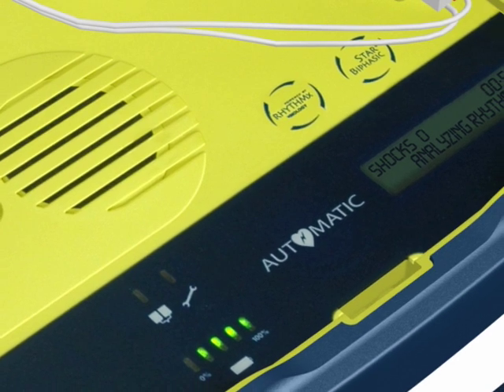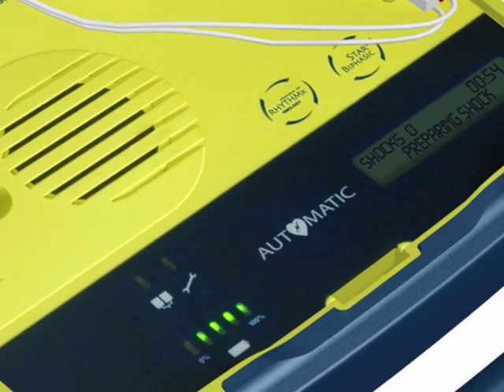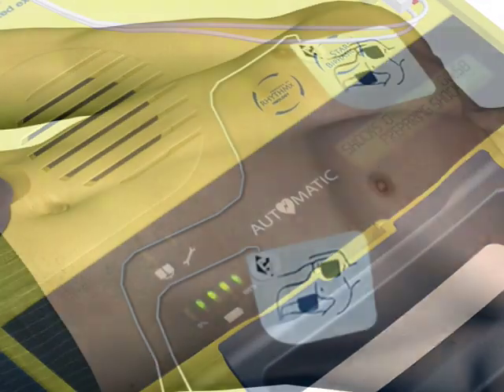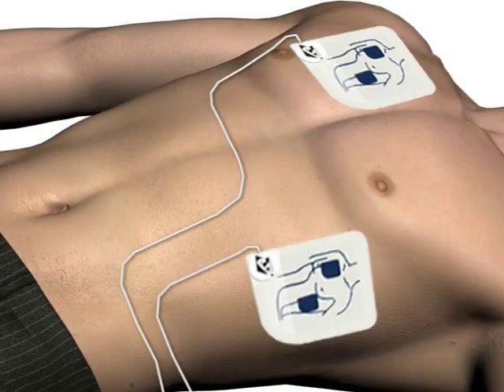If a shock is advised, the voice prompt will say: Preparing shock. Move away from the patient. Shock will be delivered in 3, 2, 1. Shock delivered.